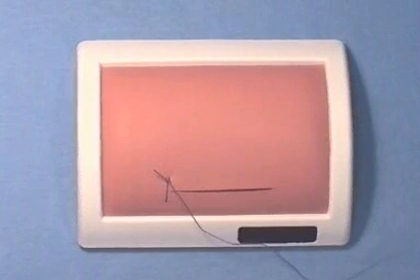Sometimes it is necessary to use a continuous suturing technique. This is demonstrated in the video.